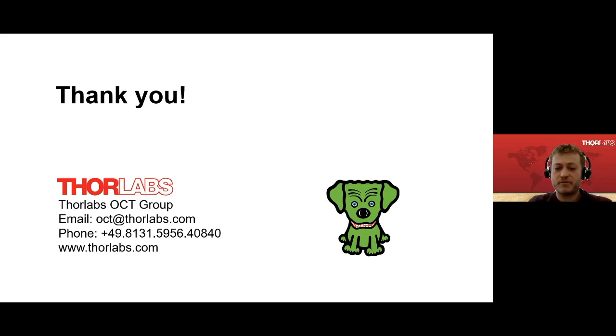That becomes different if you go to different technology. If it's no longer scanning OCT but, for example, full field OCT, where you can get to really high resolutions, that's where people still use time domain OCT. I'm not aware of many people still using time domain in a confocal scanning scenario, but there may be some edge cases where it's cheaper, or maybe you just need a very shallow measurement range that you can scan quickly over the depths.